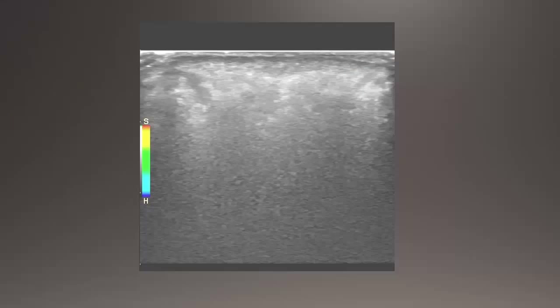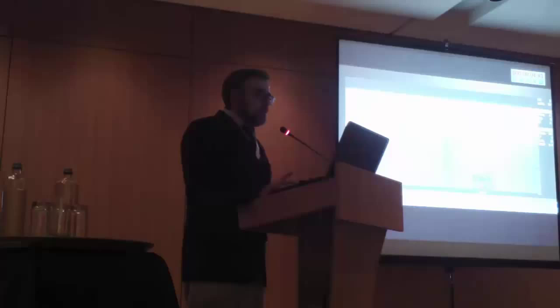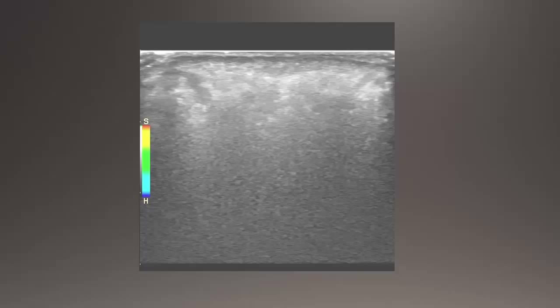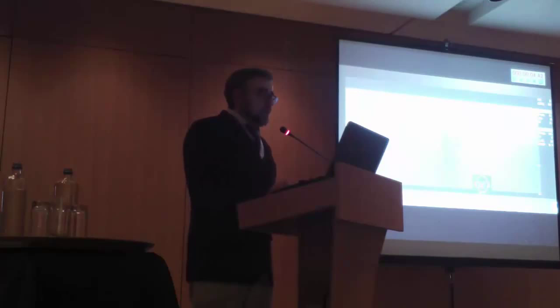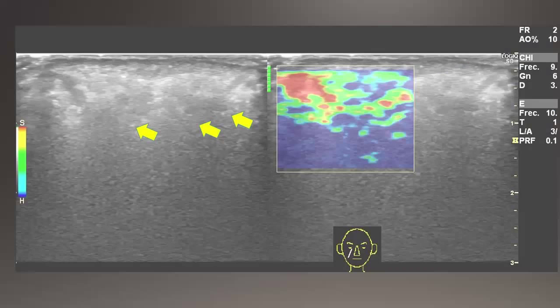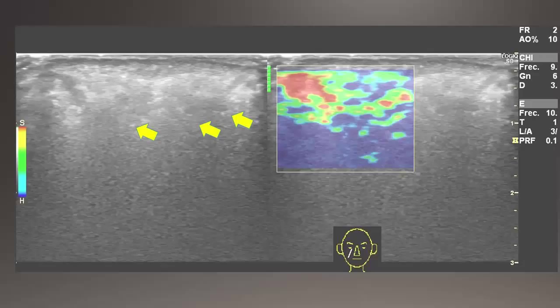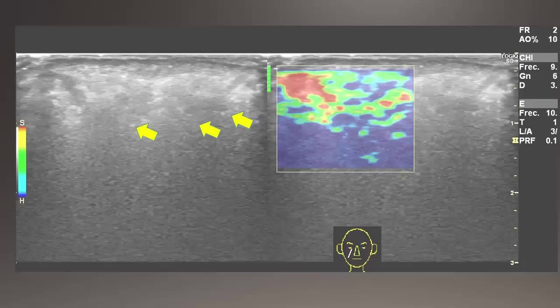In some cases it's very difficult to identify the fillers, and we have the help of elastography. In difficult cases, elastography is going to show us hidden vesicles — you can see them appearing as rigid areas. These were hidden on standard imaging, and with the aid of elastography we found more implants there that were causing symptoms to our patient.